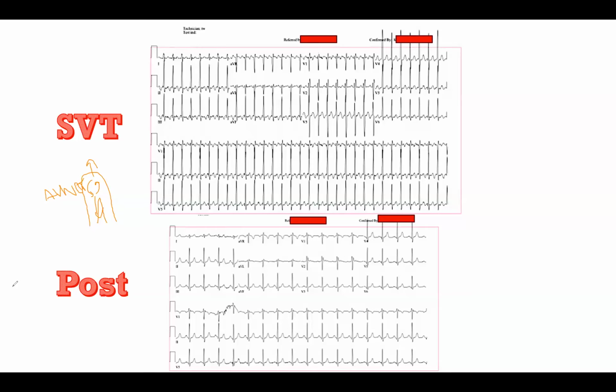And many of you know that when we're sitting in the control room prior to the case trying to figure out what the mechanism is, I generally don't think that I know the answer to that question very well, because it can be very challenging to see the retrograde P waves, not to mention the fact that this is obviously a very poor tracing because it's been copied and scanned and then scanned again.